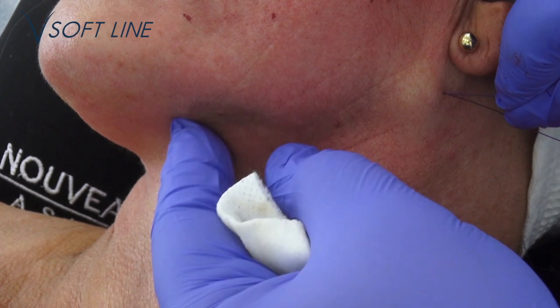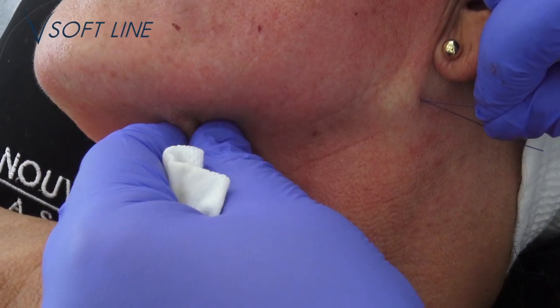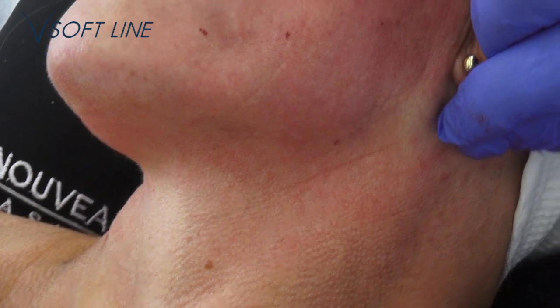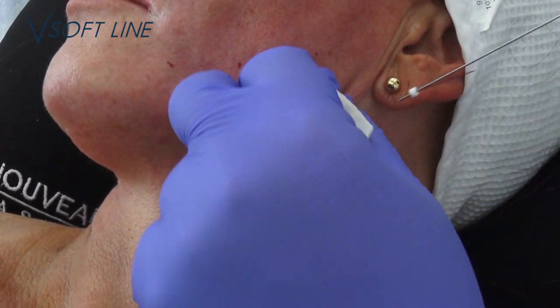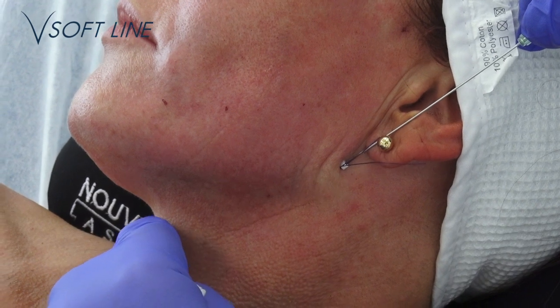If there are ridges in the skin, you must pull the skin back and forth in different directions so that the barbs, these cogs, are released. Then you pull simultaneously. And look, I have successfully positioned the threads exactly where I want them. Now I'm going down to this point.